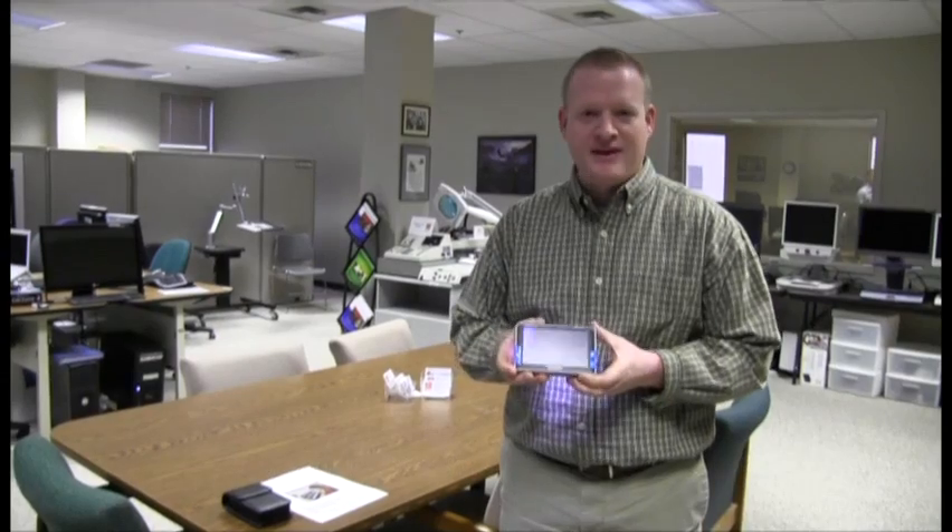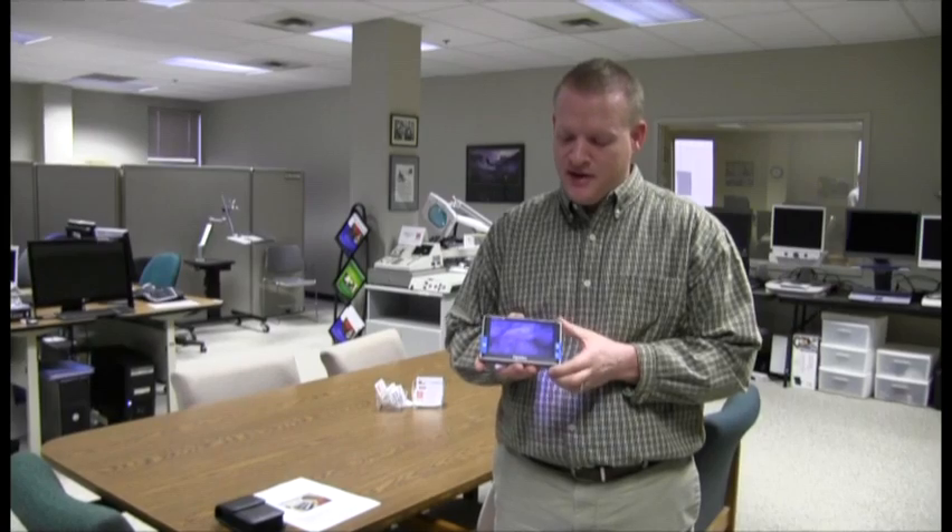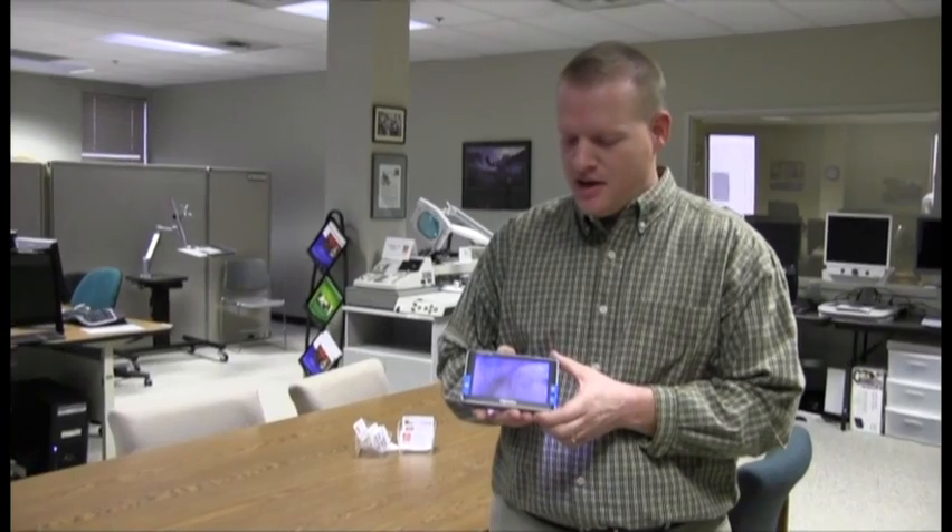Hi, glad to be with you guys today. Today I want to demonstrate to you the Compact 5 HD handheld video magnifier by Optelec. What's really nice and unique about this device, compared to other handheld CCTVs that are out there, is the fact that this one's HD quality. So it has an HD camera, and it provides you really crisp, clean images with what you look at.